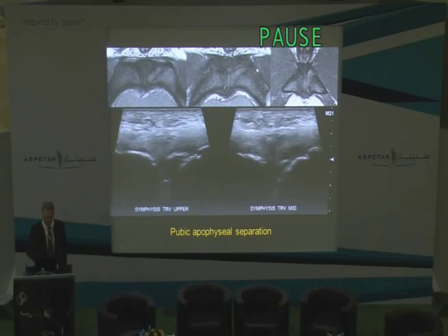And we see the same thing on the MRI. We see a widened physis, and we see this very thin high signal line which is a separation of the plate.